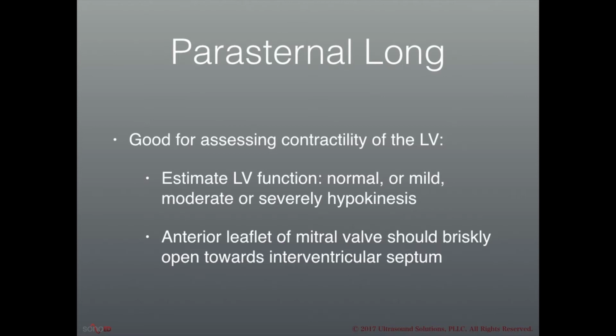When you're talking about assessment of the left ventricle, one of the things you want to do is assess how the mitral valve is opening. And if the anterior leaflet of the mitral valve is opening briskly so that it's almost touching or touching the septum, then that probably represents pretty good function of the left side of the heart.